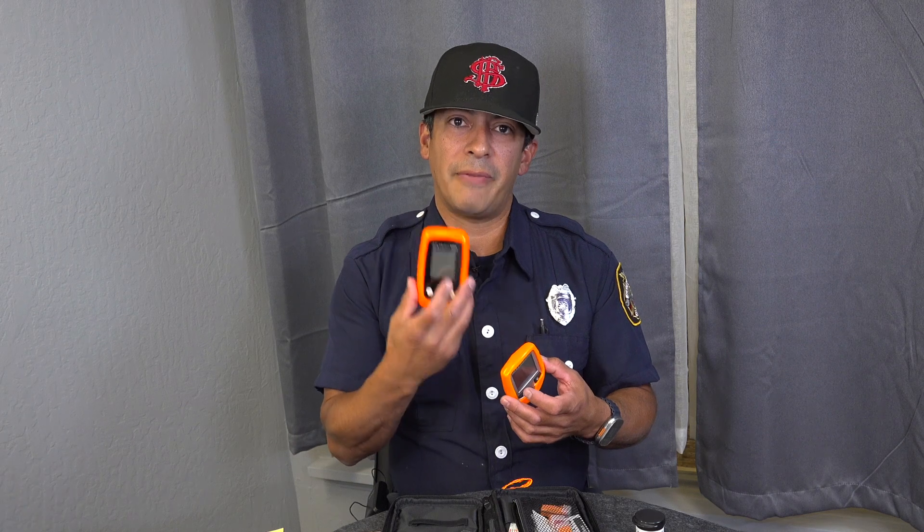I wanted to clarify why we went from the old Micro Dot Extra to the Micro Dot Pro. The primary reason is because the manufacturer does not make those anymore and I can't get any more, so the company gave us these as a one-for-one swap out.